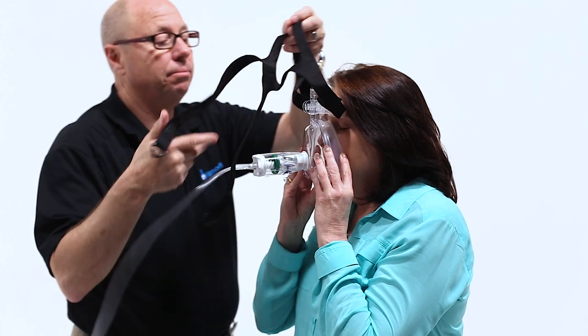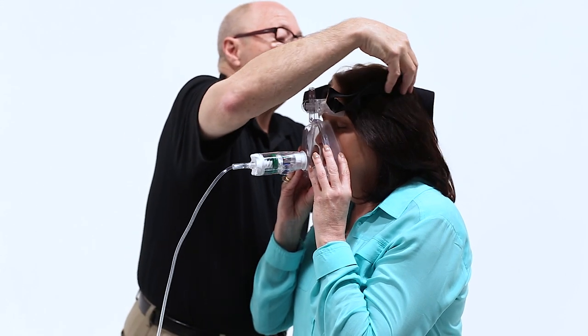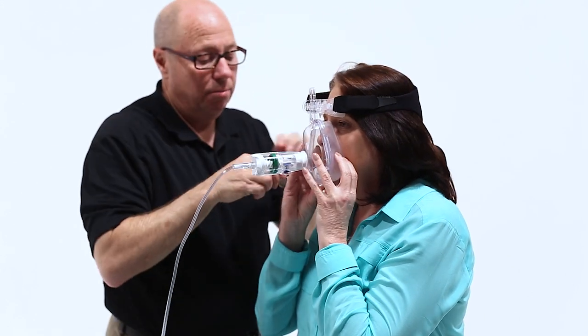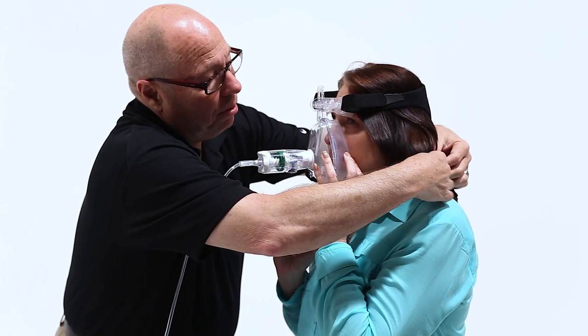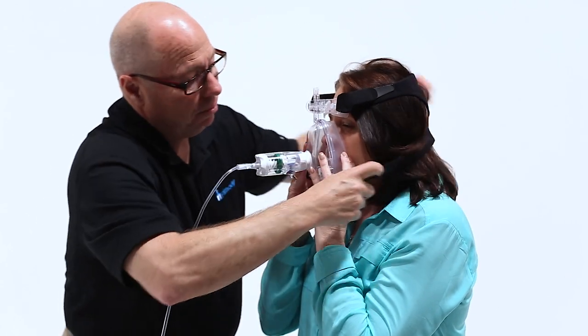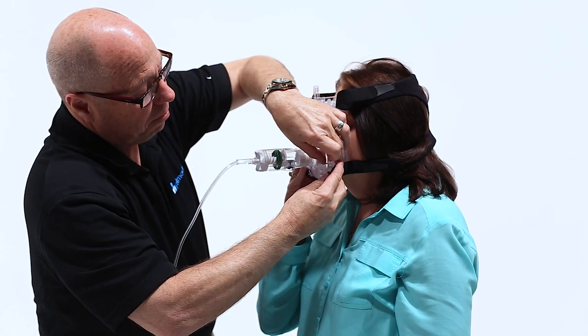At the top, place the straps up and over the patient's head. You will connect the mask at the bottom using the clips. Once you've placed the clips on either side, you will pull the Velcro to tighten the mask.